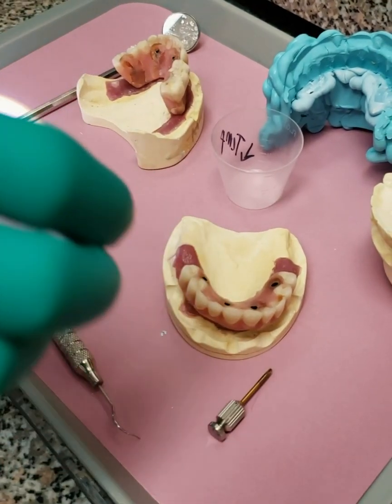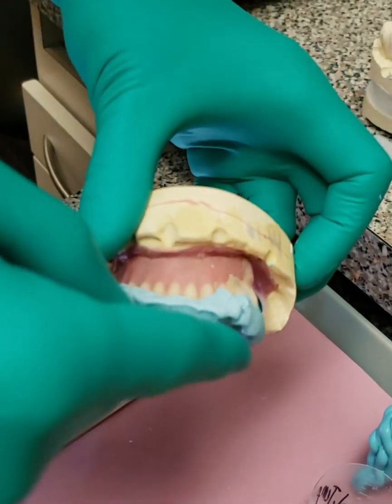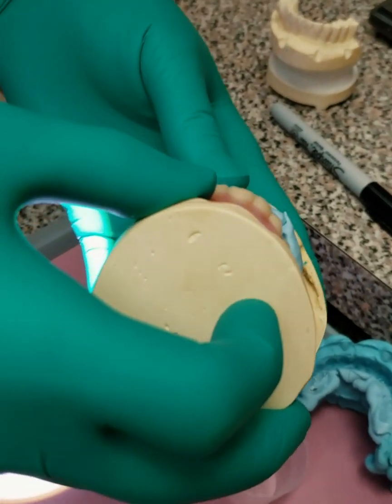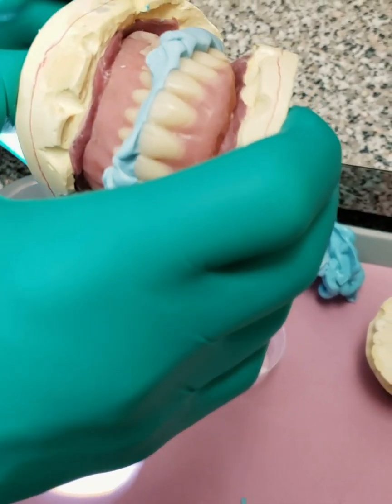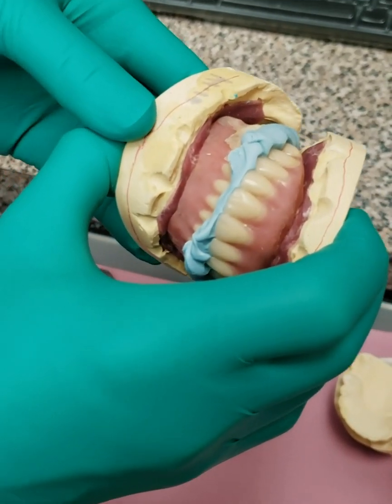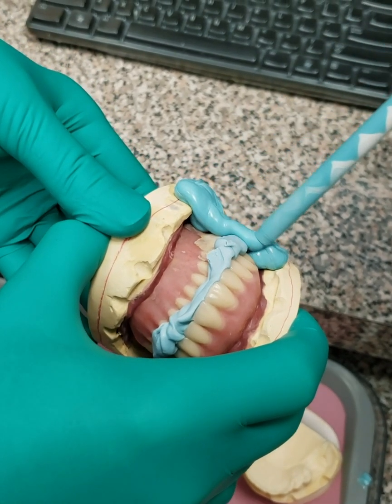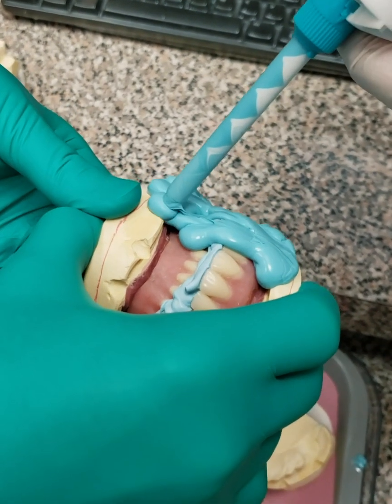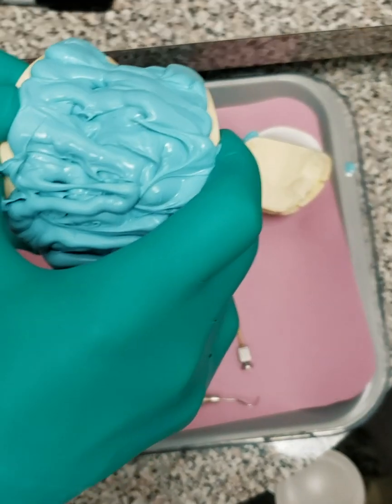Now, once that's done, what you do is take a second bite that you've taken and add it so you then have the upper and the lower. This will relate the upper working model to the lower working model, and then you do exactly the same thing that you did with the other one. While the doctor holds, again, you go from model to model without rocking, and then you hold until it's set.